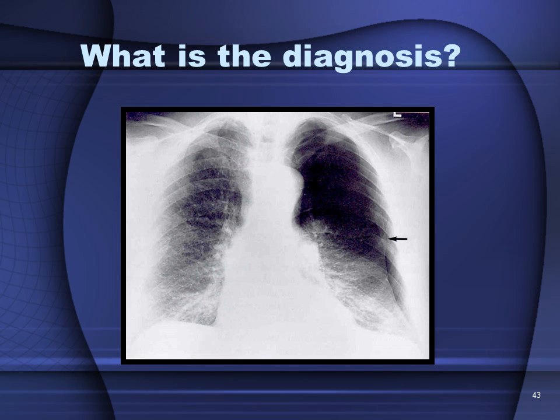Let's try to interpret another chest film. You are the physician. What is the diagnosis? It's always useful when the image given to us has an arrow on it, as here on the left side of this film. So if we get our orientation, this is left and this is right. And there's a lot of heavy white haziness, but for all practical purposes, we can interpret what we need to do in this film, although it is underexposed.